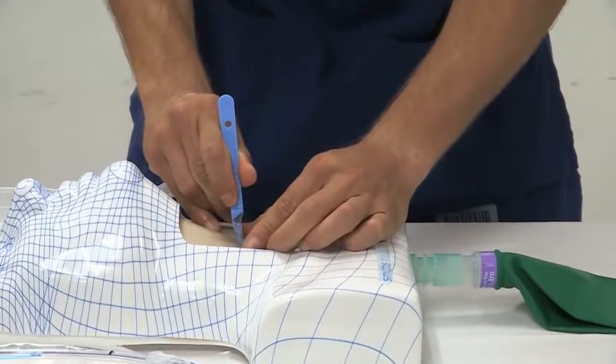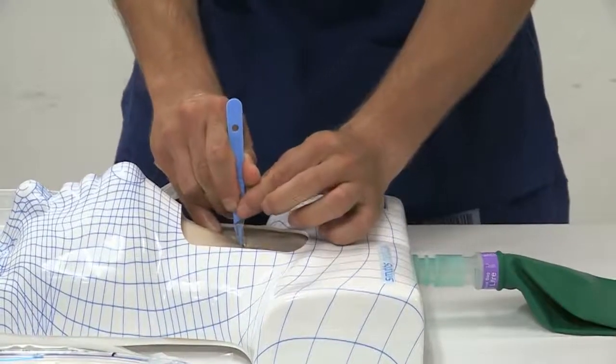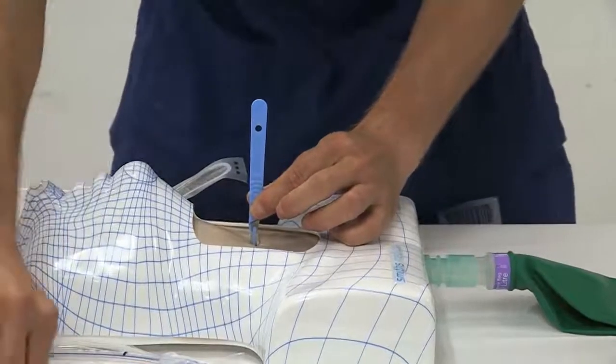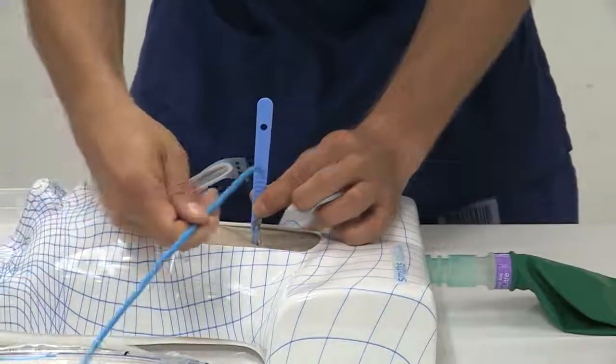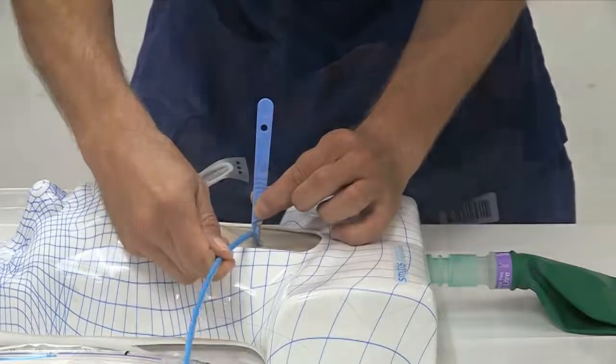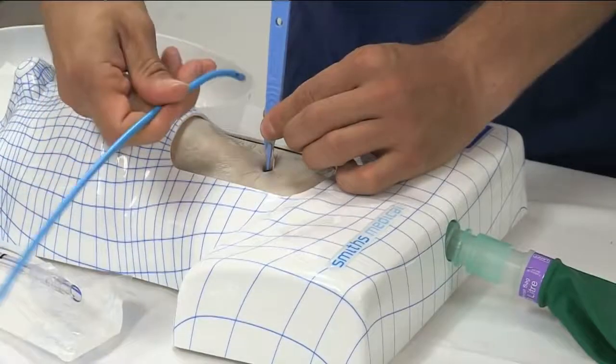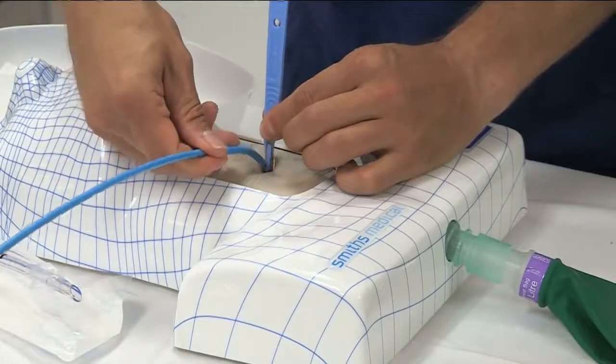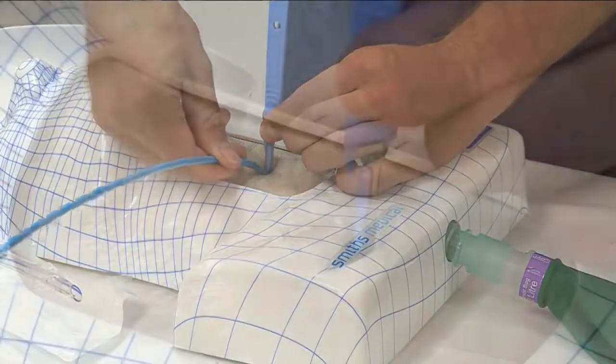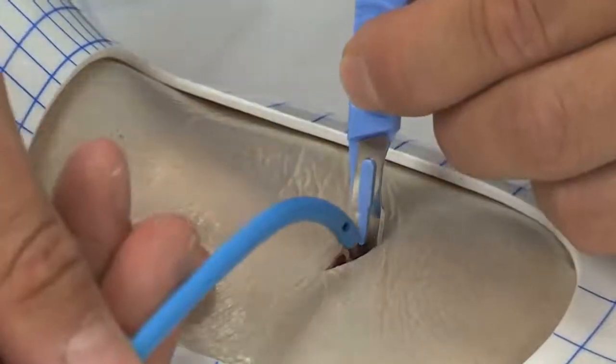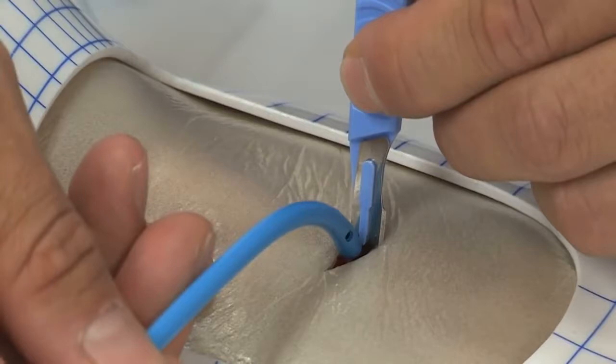The operator should now switch hands so that the non-dominant hand holds the scalpel. The dominant hand now holds the bougie parallel to the floor, pointing away from the anesthetist. The tip of the bougie is then inserted into the airway whilst maintaining contact with the scalpel blade and using the blade as a guide into the opening of the airway.